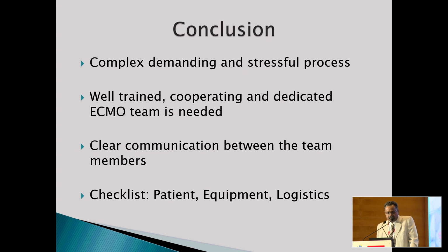In summary, the transfer of ECMO is a complex, demanding and stressful process. A well-trained, cooperating and dedicated ECMO team is needed. Clear communication should be there between the team members, and a checklist is mandatory. Thank you from our team.